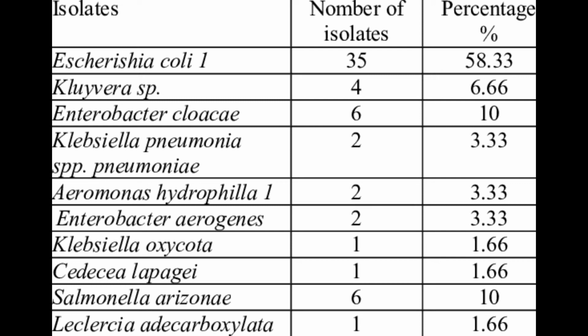Slow lactose fermenters lack permease. The medium is ONPG broth with 3 to 6 hours of incubation. If positive, the medium is yellow from O-nitrophenol. If negative, the medium is colorless.